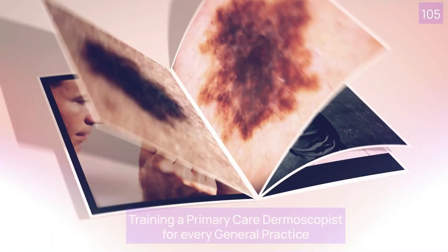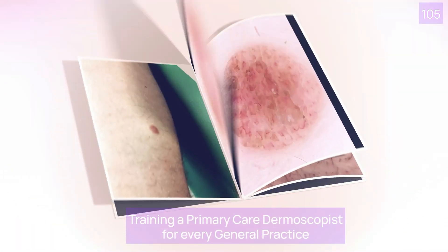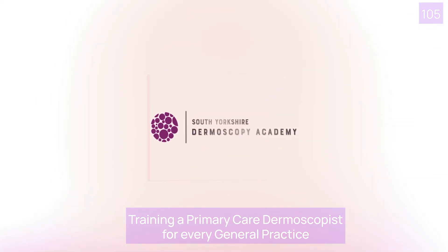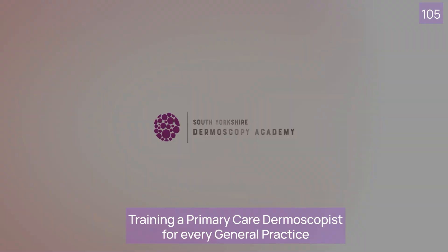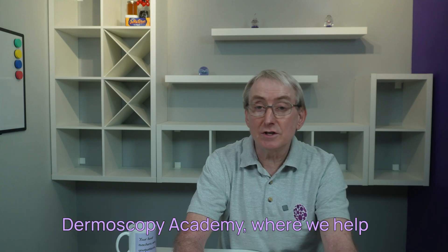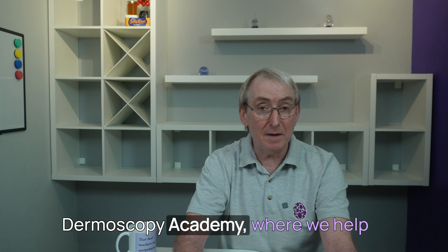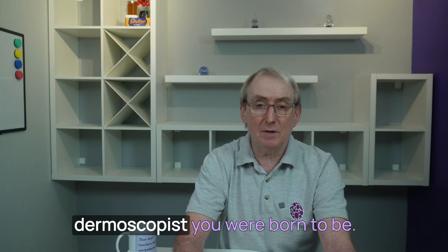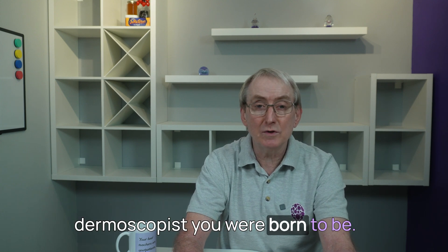In this video we'll consider sebaceous hyperplasia: what it is, how to diagnose it using a dermoscope, and why it matters. I'm Andy from the South Yorkshire Dermoscopy Academy, where we help you become the great primary care dermoscopist you were born to be.